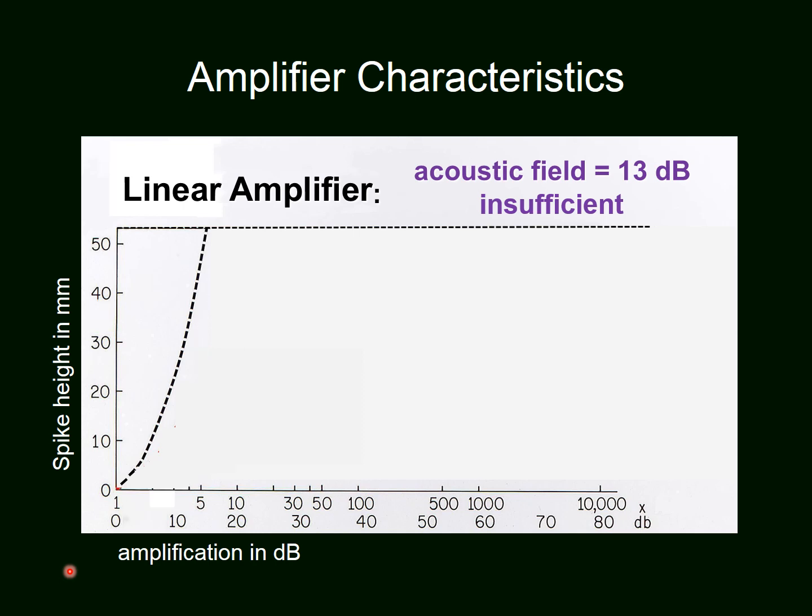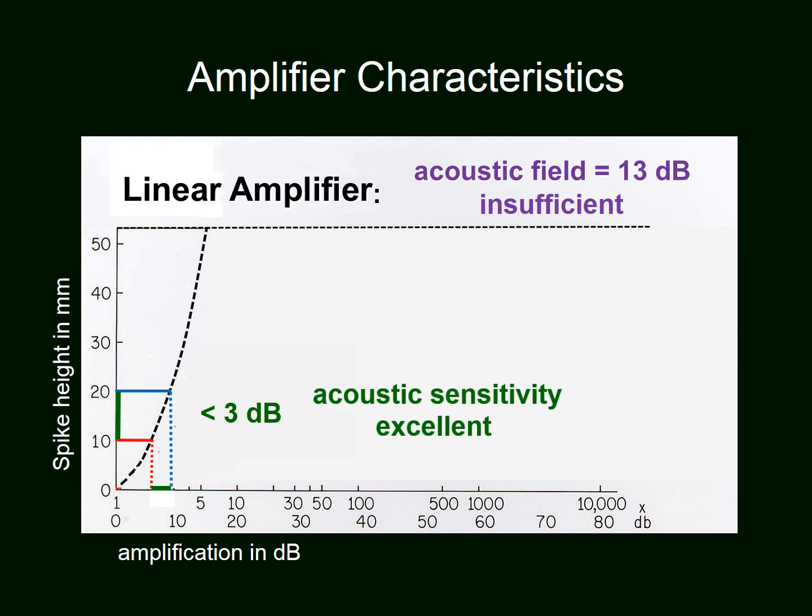On the other hand, when we look at the decibels needed to increase spike height from 10 mm, we need less than 3 decibels to achieve that. And that is an excellent acoustic sensitivity.